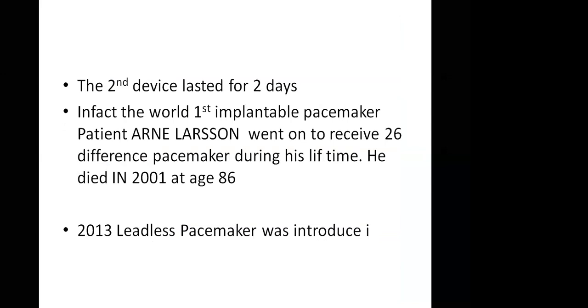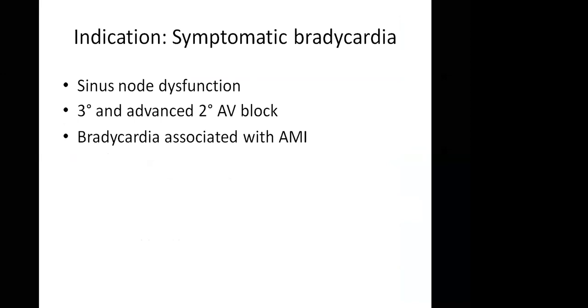Let us not bother about the history. We all know everything about the pacemaker and its history. We all know the normal EKG. So, indications for pacemaker. We all know that a pacemaker is used for sinus bradyarrhythmias, and apart from that, you can also use the pacemaker in some cases of tachycardia. So what condition in tachycardia would this pacemaker be for? If the patient has tachy-brady syndrome. The main reason you use a pacemaker in tachy-brady syndrome is that when the patient has tachycardia, you want to block and pace.